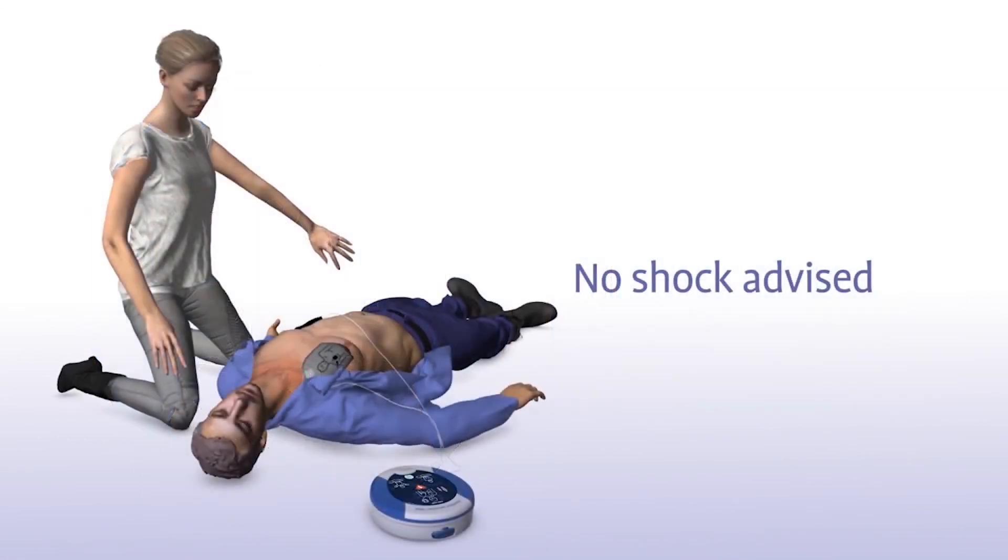Sometimes no shock is needed in a life-saving situation, and the Samaritan PAD will tell you in that instance with a no shock advised prompt.